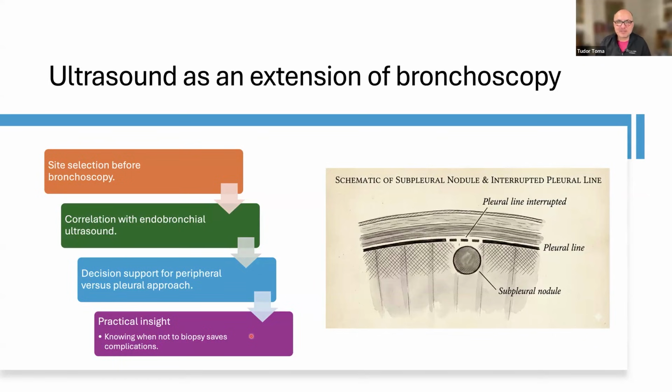So maybe it's my frustration which makes me stress a little bit the advantage of thoracic ultrasound: the examination of the chest from the outside of the chest with the ultrasound, not only from the inside of the chest with the ultrasound.